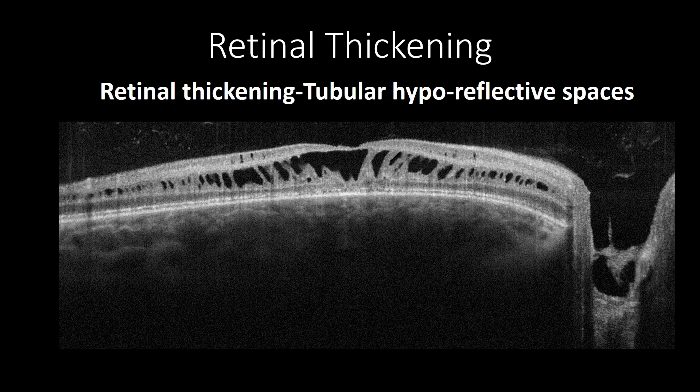This case of X-linked retinoschisis shows an increase in retinal thickening with tubular cystic formation. As the disease progresses, those tubular cystic spaces may coalesce.